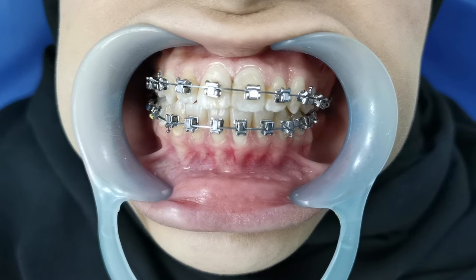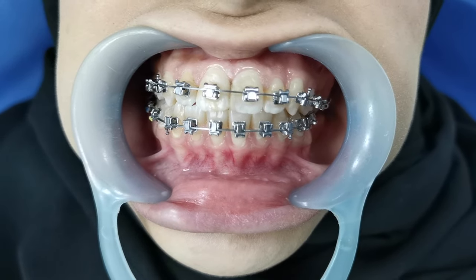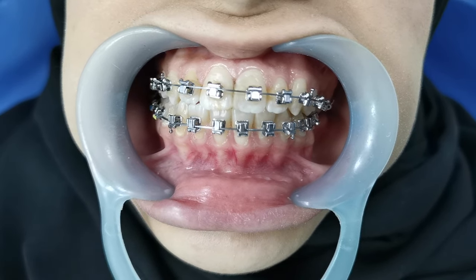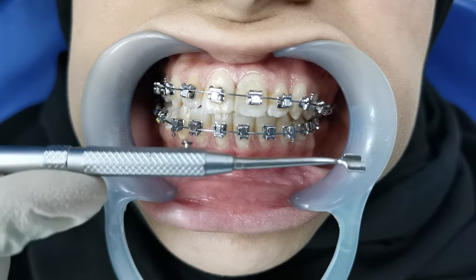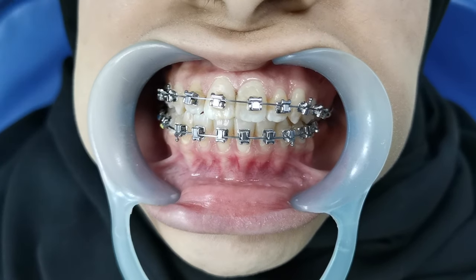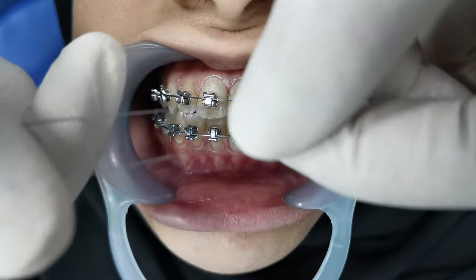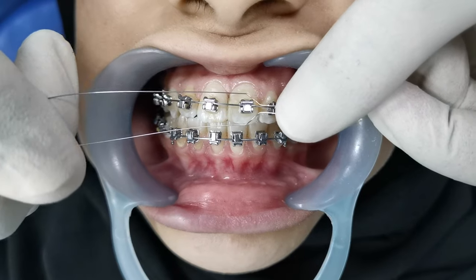Hello, beautiful people of the world. In this video I will show you the process of doing ligation. This is the ligature wire tucker and this is the ligature wire director. Here the ligature wire tucker and the twister. We need a ligature wire. Bend it at a 45-degree angle and then insert on the bracket.